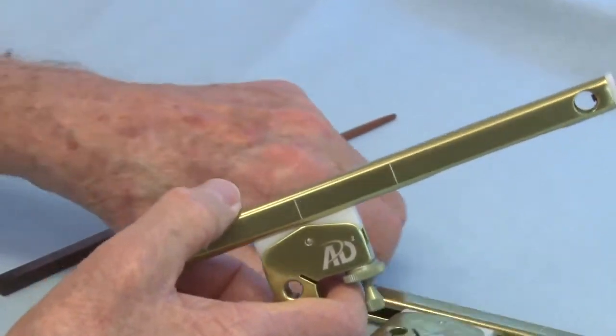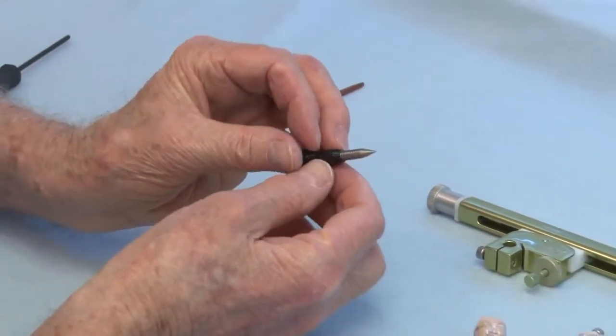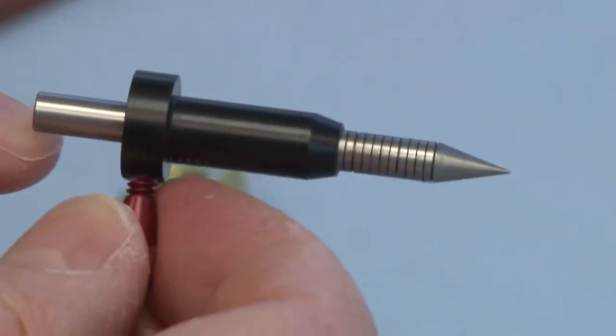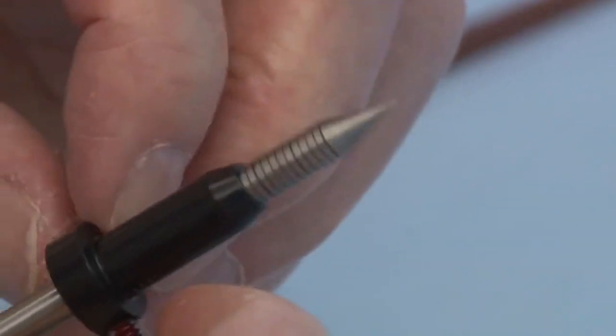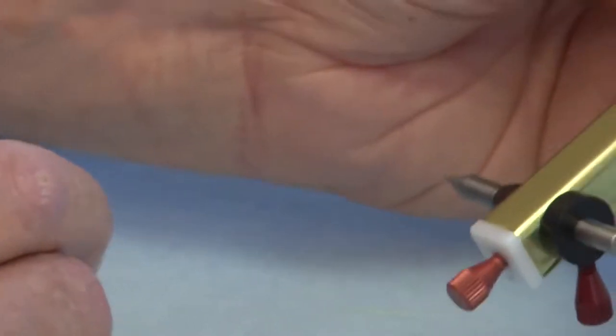Now the side arm, also we have a stylus pen. This is a stylus pen, and it has a sharp point and a dull side. We've referred to the black part as a bullet. The bullet has a collar on it, which means that you can move it in. You can seat it only to the maximum of the collar. The collar runs into it, and that's as far in as it will seat.